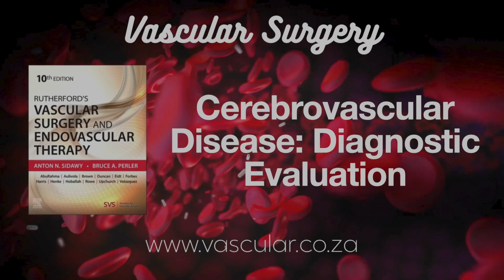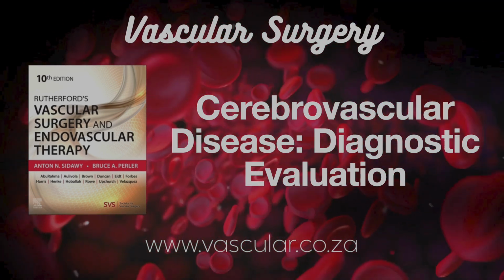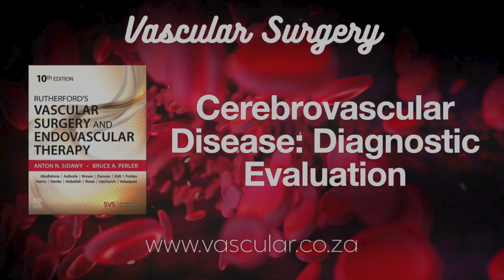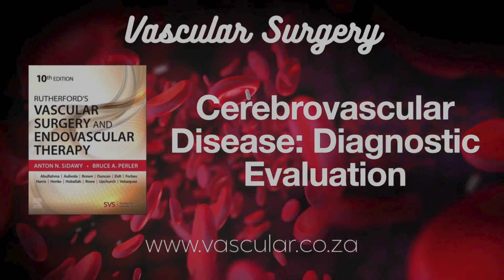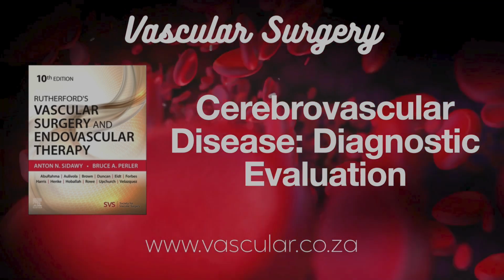Let's move to another technique. CT angiography, CTA. What's involved? Right, MDCTA, multi-detector CT angiogram. This has been a huge step forward. It's basically a very fast CT scan using X-rays and an intravenous contrast dye. The dye makes the blood vessels light up on the scan.